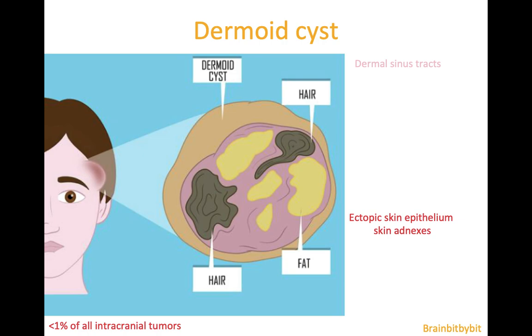In this brain bit by bit, I'm going to show images of dermoid cysts, which can occur anywhere along the midline and are pretty rare intracranially.